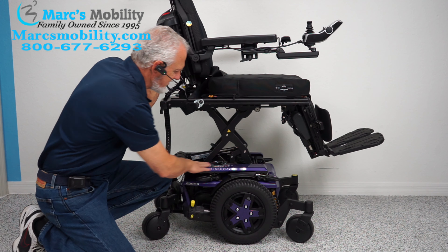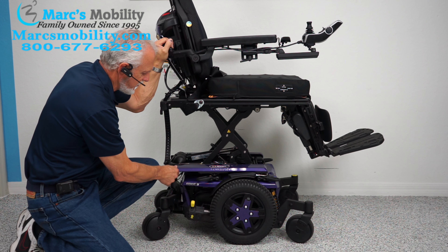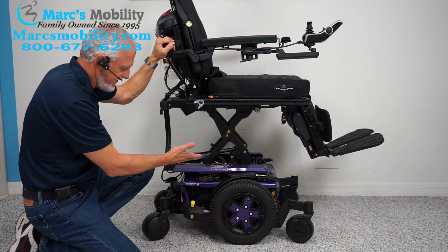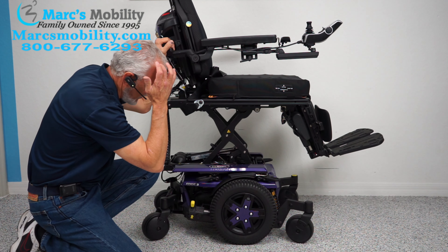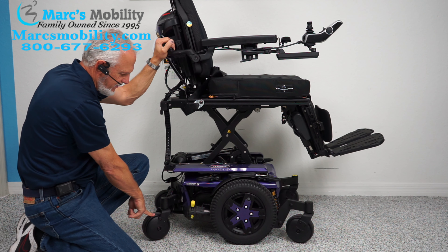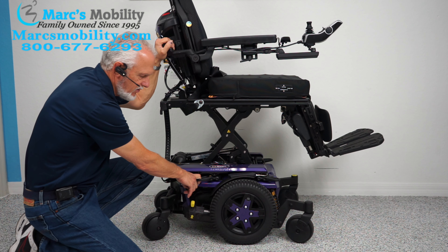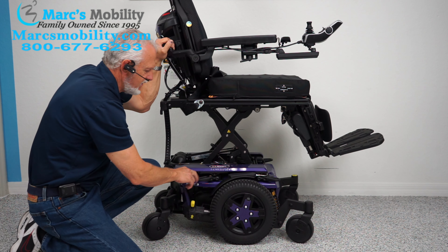The seat is elevated right now. You can see the color is purple. If this is the chair you want but not the color you want, let us know — we might be able to switch that color because these are just cosmetic covers. We'd like to sell it with this color if we can. It has matching wheels also — 14-inch solid wheels that will not mark your floor. Castor wheels in the front and castor wheels in the back, also solid wheels.